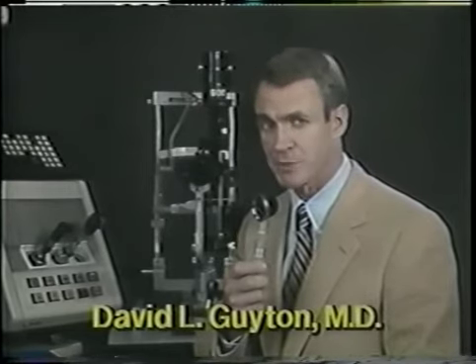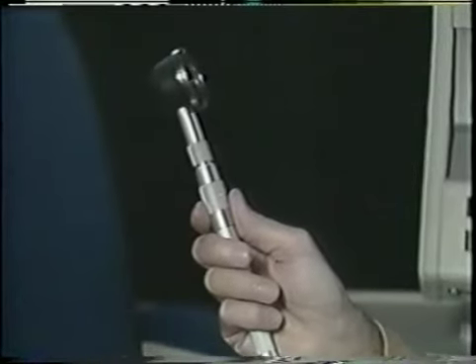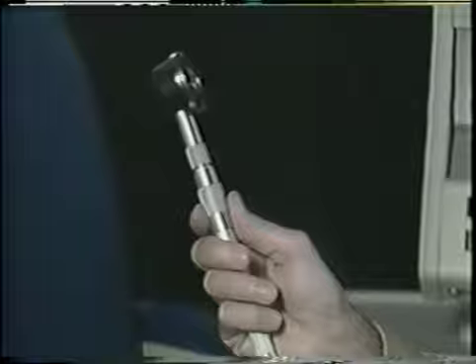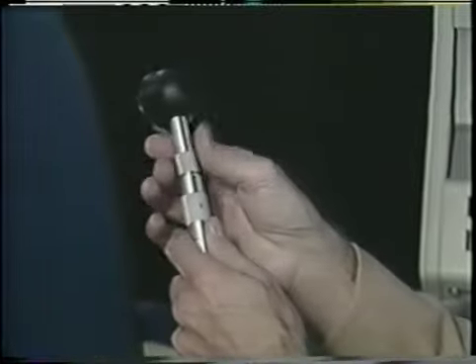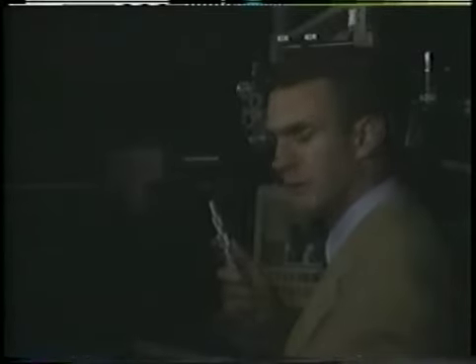The streak retinoscope was introduced in the United States by Jack Copeland in the 1920s, replacing the older spot retinoscope. The familiar Bausch and Lomb streak retinoscope has changed little in the intervening years. A lamp with a linear filament is moved up or down inside the handle by a sleeve on the outside. For our purposes, we'll almost always hold the sleeve in the up position, projecting a band of light called the intercept. We'll sweep this band of light across the patient's pupil during retinoscopy.